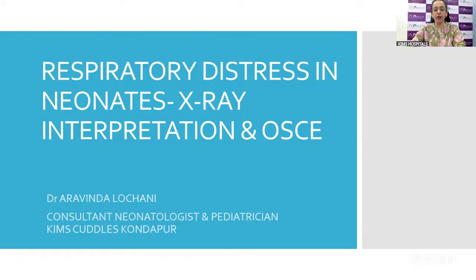In today's webinar, we will discuss respiratory distress in neonates and X-ray interpretation of the same, and some case-based scenarios and OSCEs regarding the same. Since X-ray is the most commonly used modality in NICUs, even in smaller setups, we use X-rays day in and day out. So I have included a few X-rays and cases which we have treated at KIMS Cuddles Kondapur and will discuss the X-ray interpretation of these cases and the different neonatal respiratory conditions.